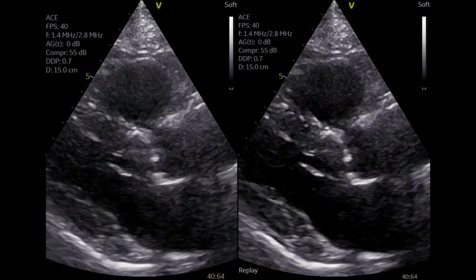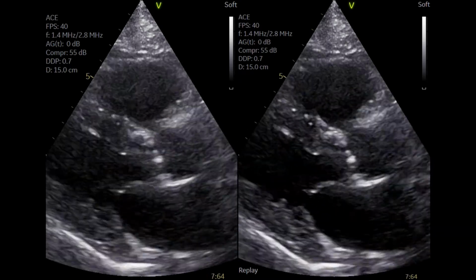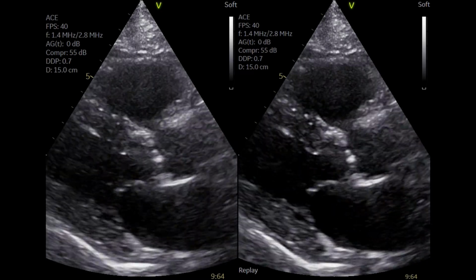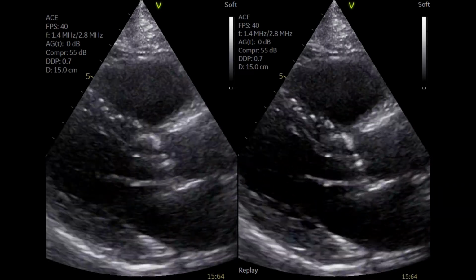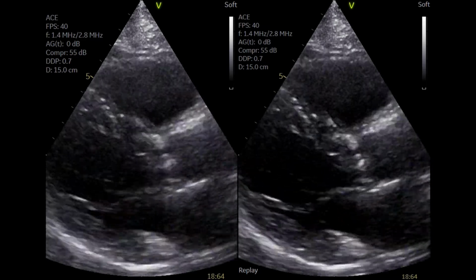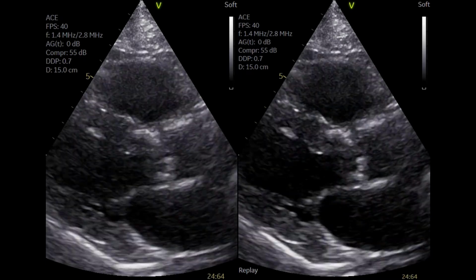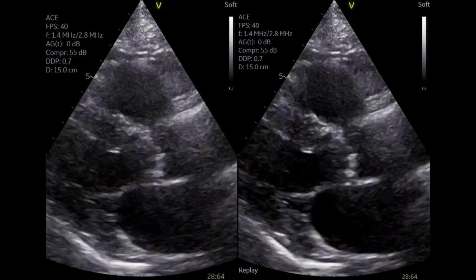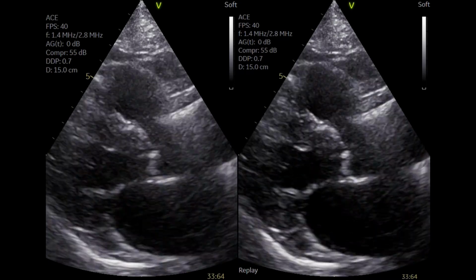In a blinded and left-right randomized side-by-side evaluation, 4 cardiologists, 2 experienced and 2 in training, evaluated image quality. The clinicians were provided with a view such as this and were tasked with selecting the image they preferred. They were able to slow down or to stop the cine loop and alter gain. The change in gain would then be equally applied to both images.